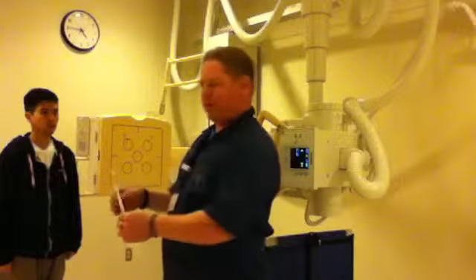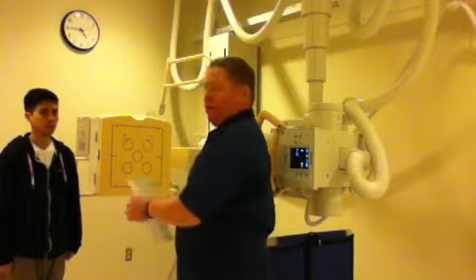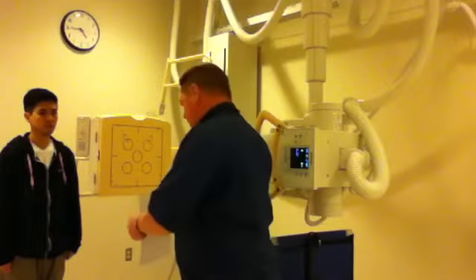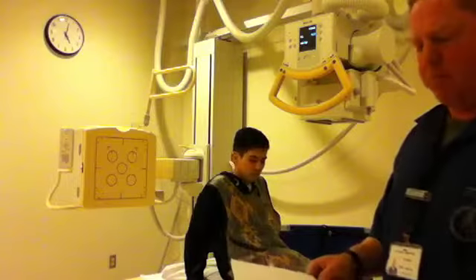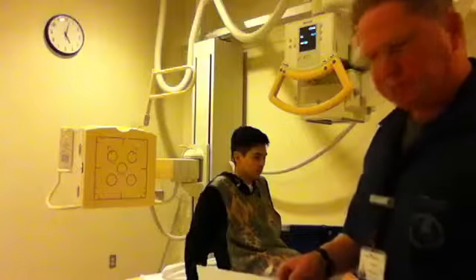So we're leaving from the waiting area. We've already left. And if by chance this was a woman, I would be asking if she was pregnant. At this point, I am going to be doing a knee exam, which is going to be AP, oblique, and lateral. I'm going to go ahead and start.